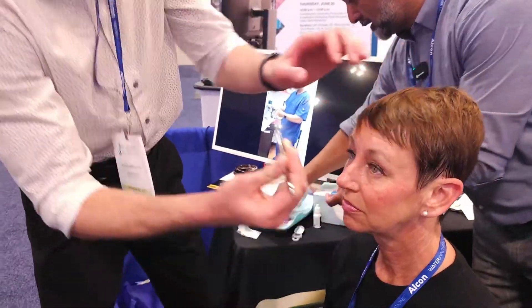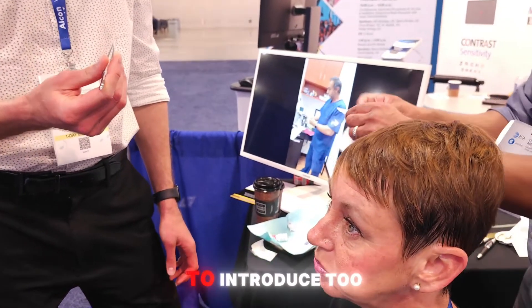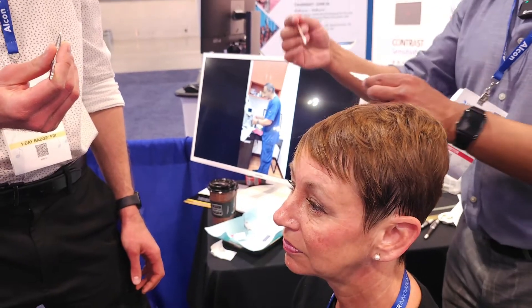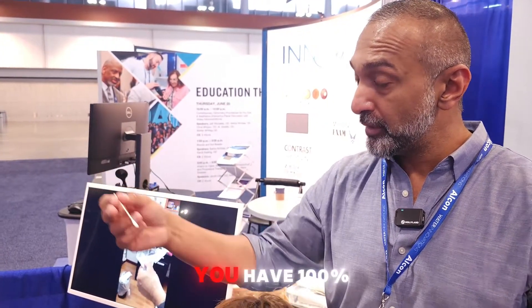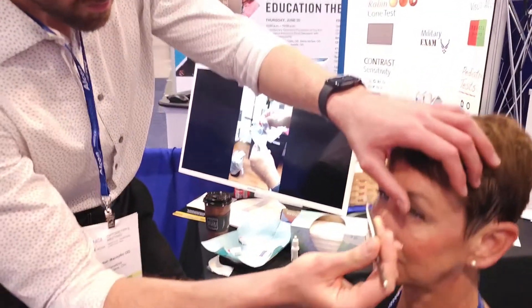I'll be your assistant — I'll have your bandage lens ready to go. We don't want to introduce too much moisture onto a membrane that's trying to adhere to the eye. Once you have it on, use the back edge of the forcep to smooth it a bit, then I'll trade with you and you'll use this to roll over it like a little rolling pin to ensure maximum surface area contact.